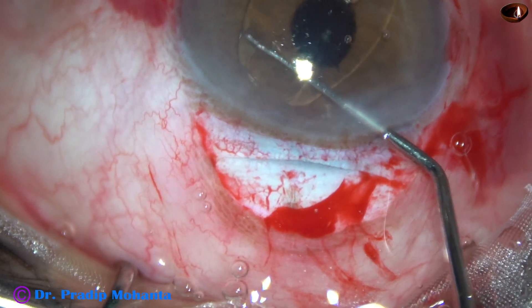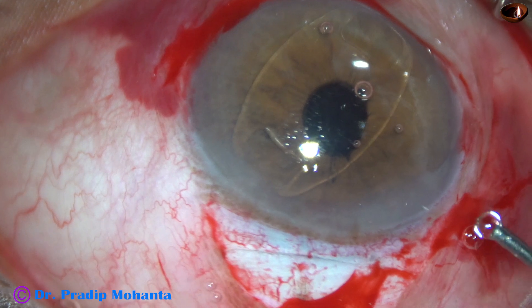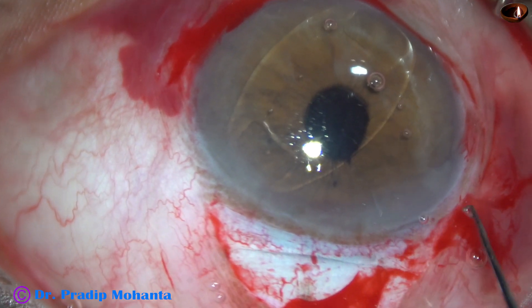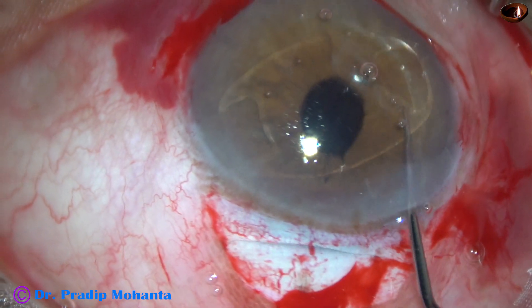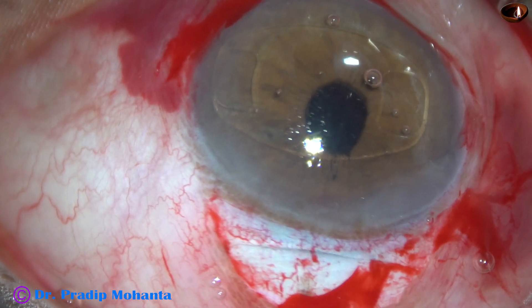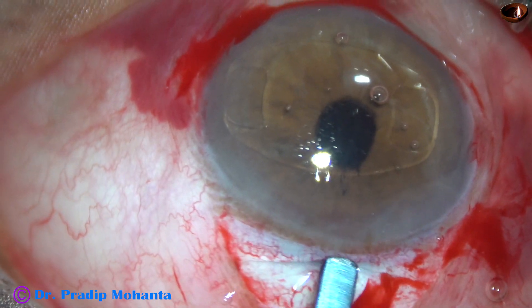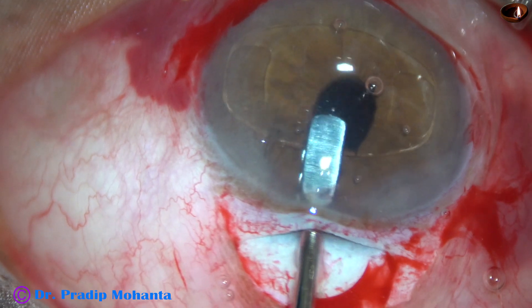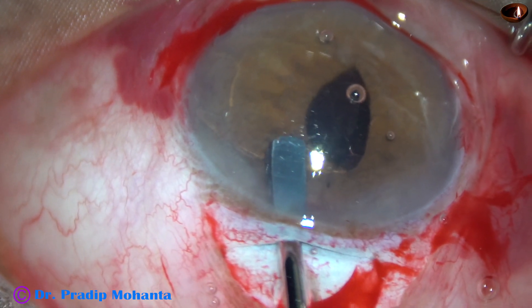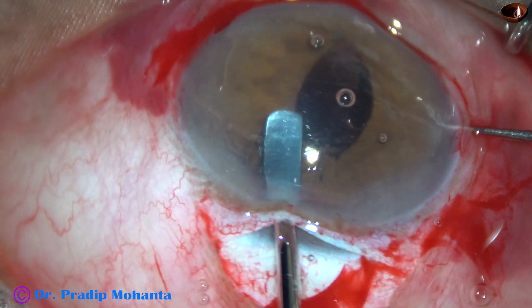I am using the main wound of the phaco for manipulation of the intraocular lens. This incision being in the anterior part, it is easy to do these manoeuvres. Now the lens has been placed horizontally. And I always do the difficult job first — the first difficult job is to hold the lens with the non-dominant hand. I have pulled the lens with my left hand and am enclaving the haptic at 9 o'clock. It is done.